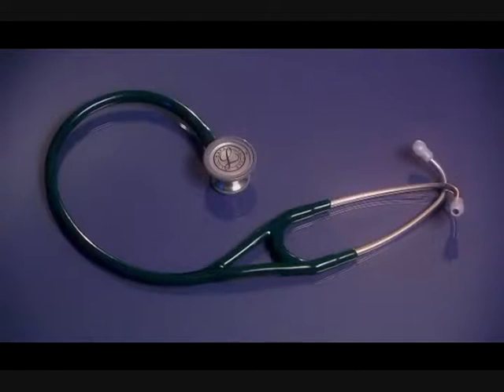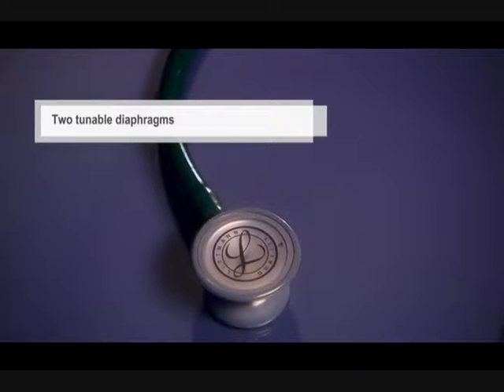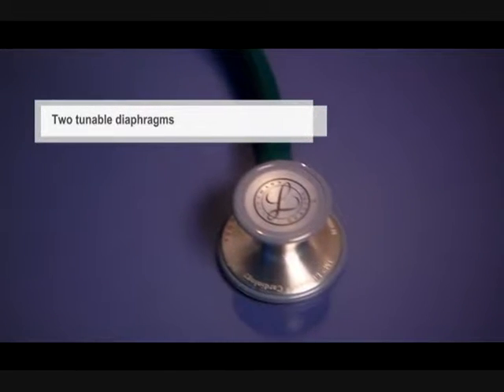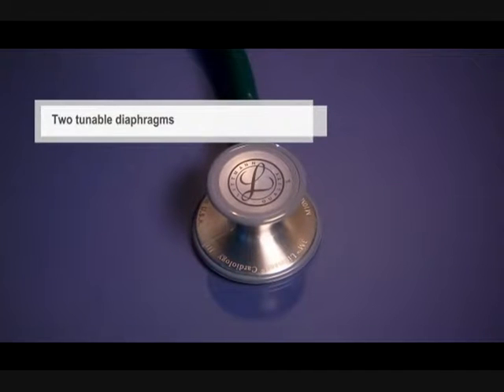The versatile two-sided chest piece is built with two tunable diaphragms — the larger size for adults and the smaller size for pediatric patients, carotid assessments, and maneuvering around bandages.